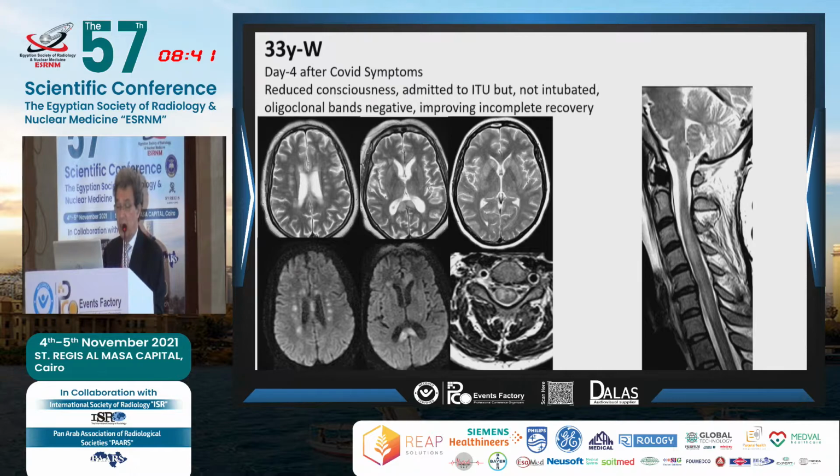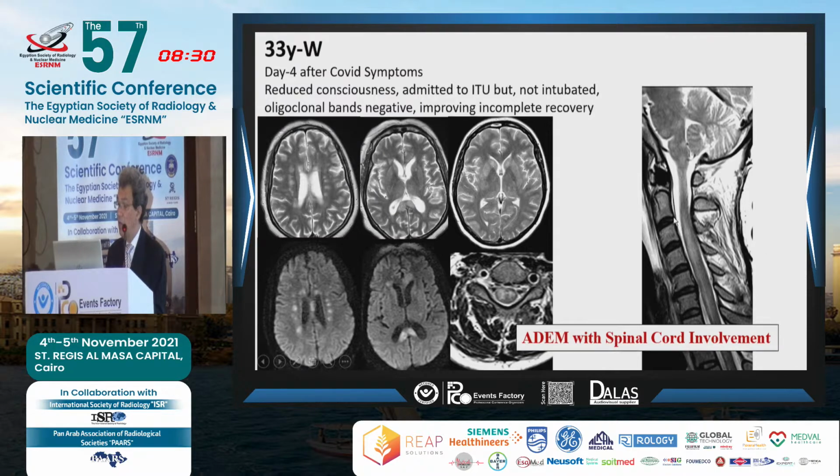This is another patient, similarly. You have a number of hyperintense changes in the T2 weighted images, can show some restricted diffusion, though not necessarily, but also involving the cord. So this was an ADEM with spinal cord involvement.